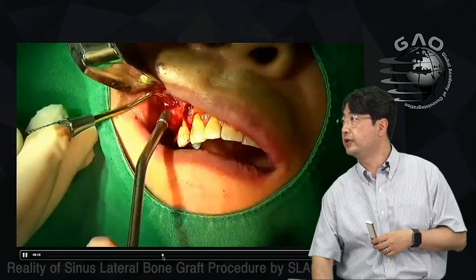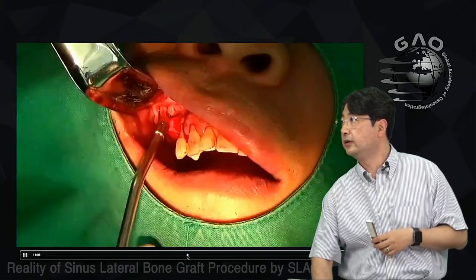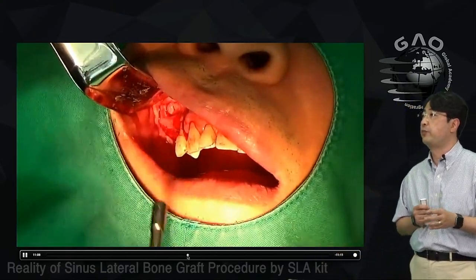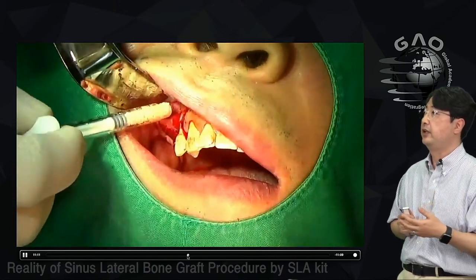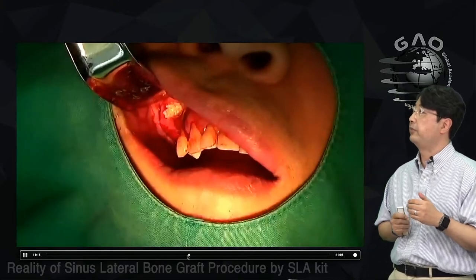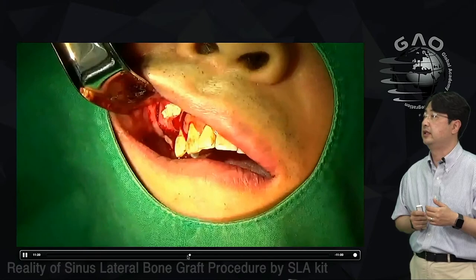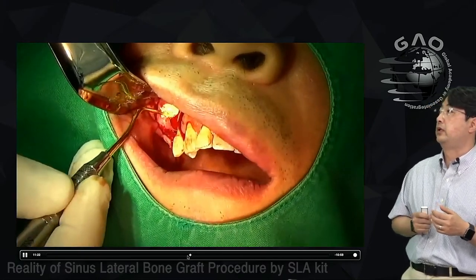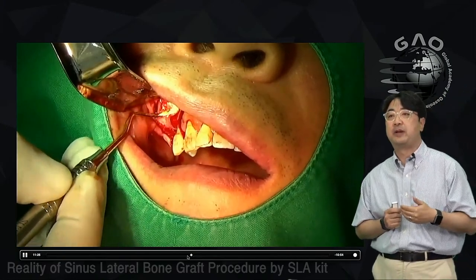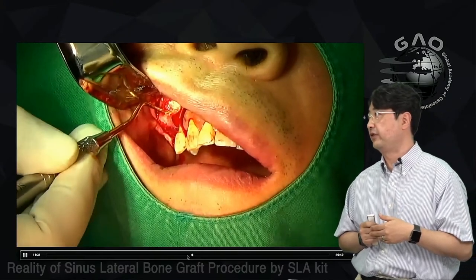So once I finish with these freer parts, then I'm ready for the bone graft. And I found there's no perforation of the membrane, right? Then I place the bone graft in the syringe. I carry it to the syringe, and I'm using the freer elevator to pack the bone underneath of the membrane to the crestal area where we want to have a graft, right?